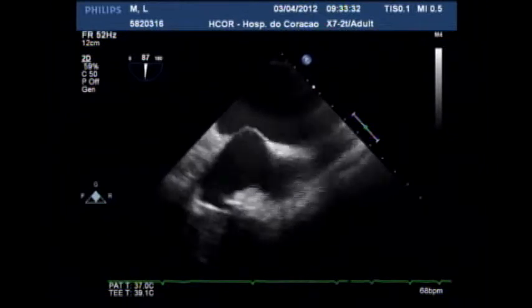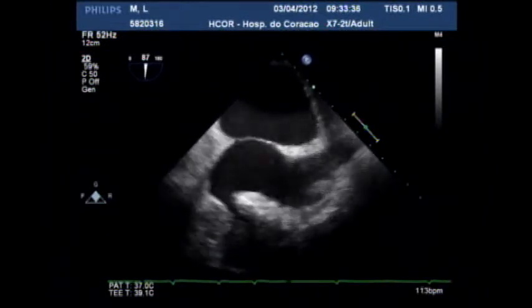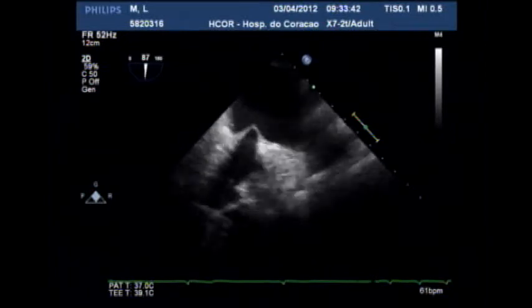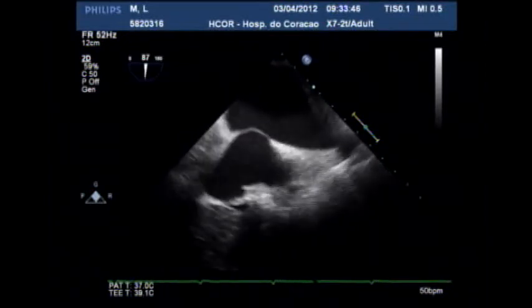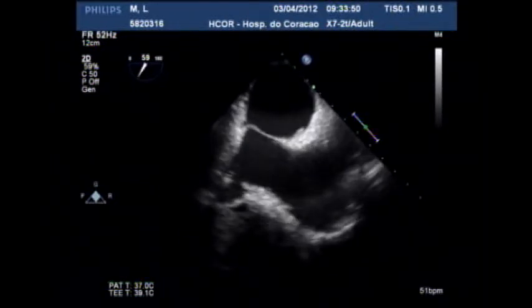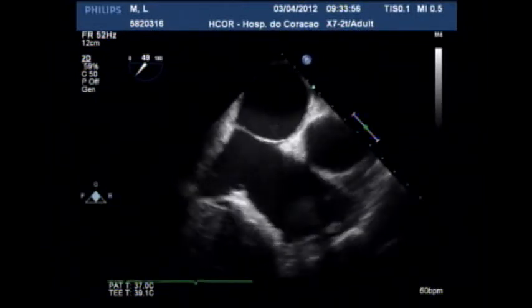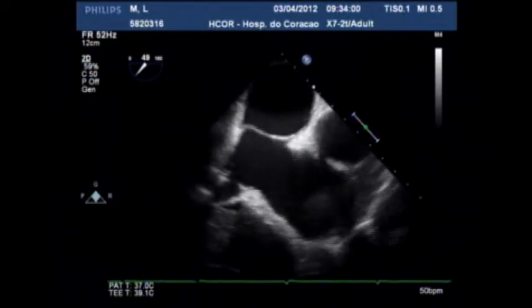I'm kind of inferior. I might bring a little bit back there. So yeah, let's go. So I'm inferior, right? This is the long axis view. So you can see some tenting in the septum. So let's rotate to the short axis view and see if I'm posterior, because the best place to puncture the septum is posterior inferior. So I'm way too posterior, right? But I like that. So I'm going to advance the needle.